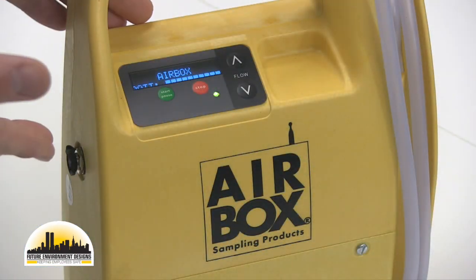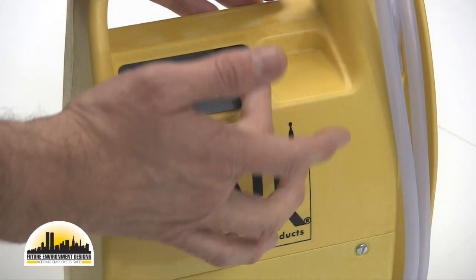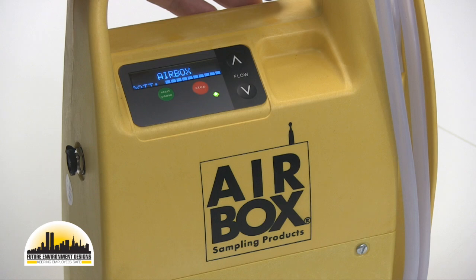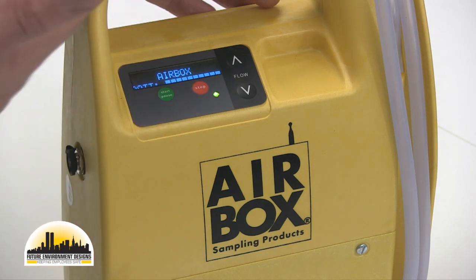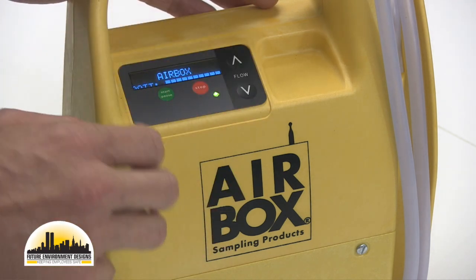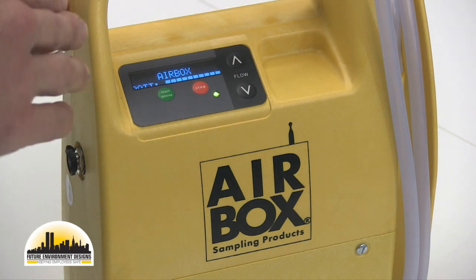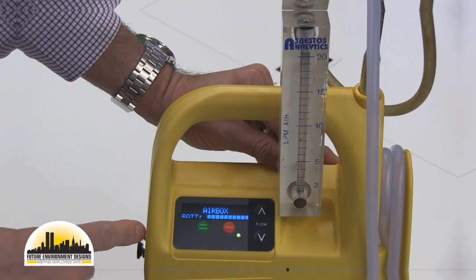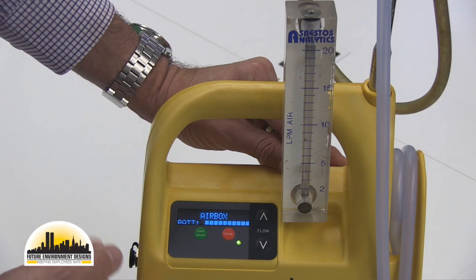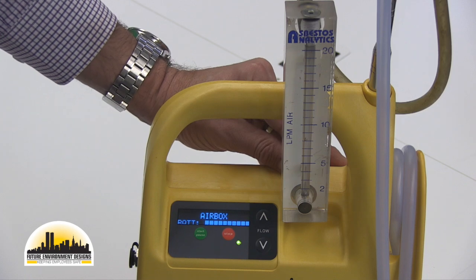So the setup for the Veriflow model is very simple, and what you can see is it's just a 4-button control. Again, just trying to keep it user-friendly. Once you start the sequence up, it'll come up with the serial number and the firmware version. But one of the things we're really keen to ensure from an ease of use perspective is having prompts. So in setting up and calibrating the flow, the screen will give you prompts to take you through that process.